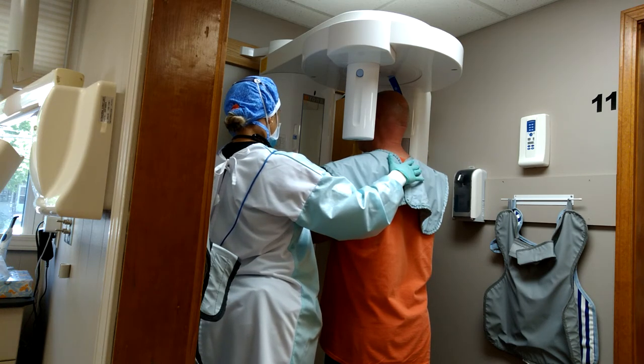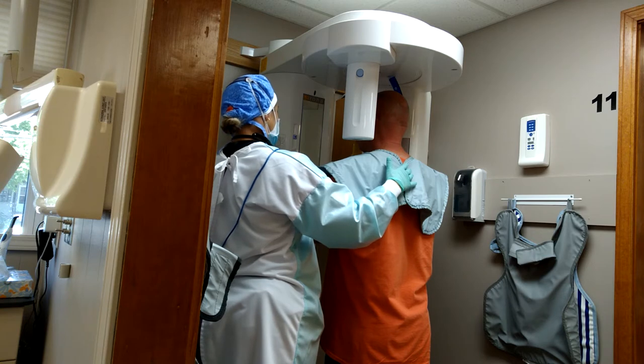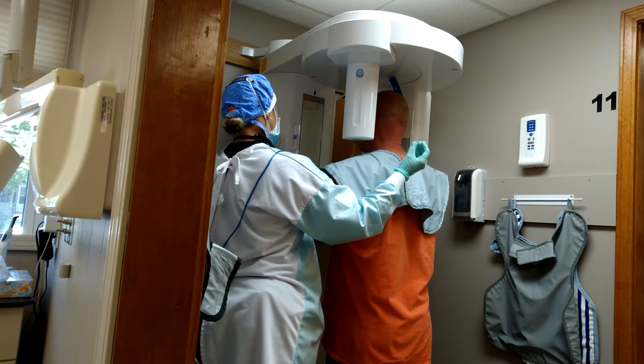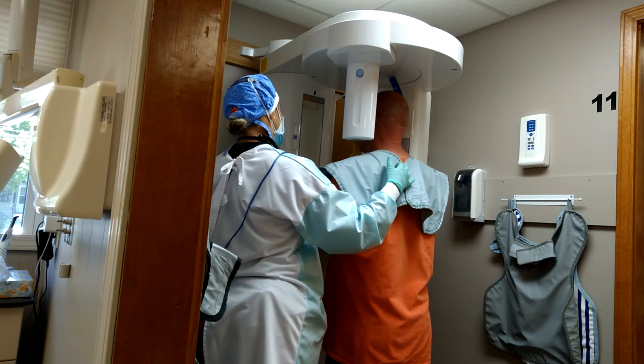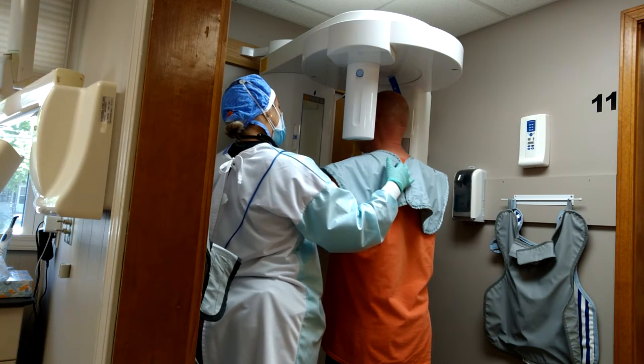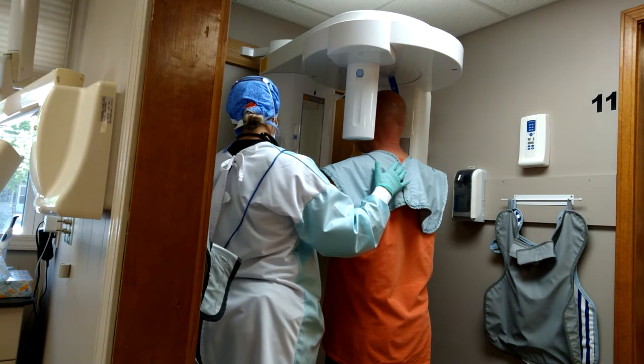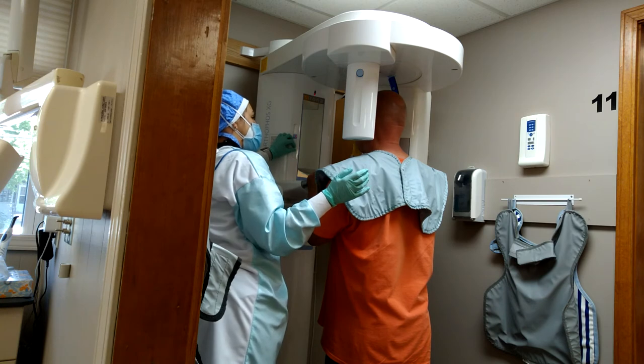That's going to straighten the back of your spine. You're going to feel these little things pop and they're going to steady your head in there. You're going to feel one go against your forehead and two go against the sides of your head — they're just going to straighten your head in there. Okay, and then I have these lights right here.